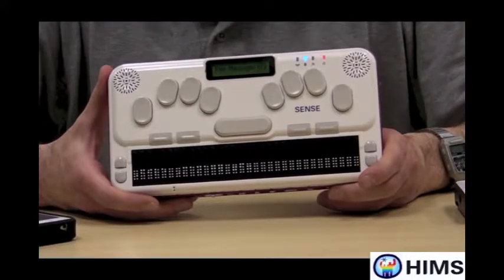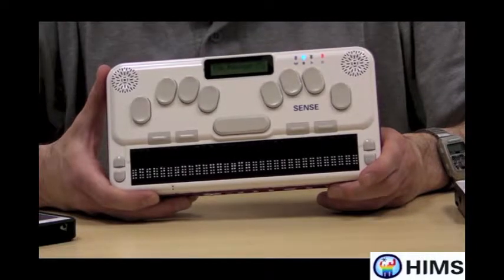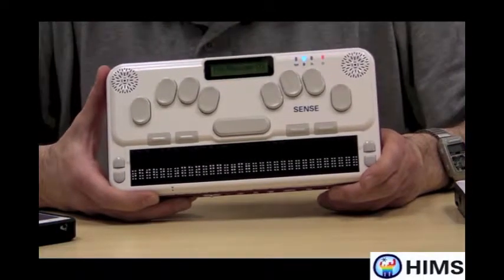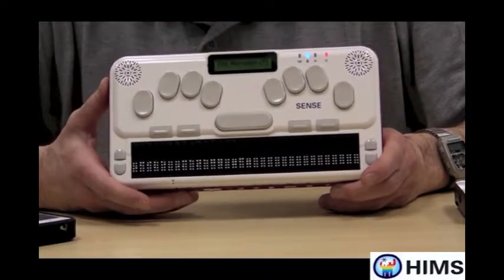It's a brand new note taker — a very fast note taker. It has a lot of storage internally, up to 32 gigs. Its processing speed is very, very fast, so you'll notice, for example, if you unzip files or if you surf the web, you're going to see a big difference from previous note takers.